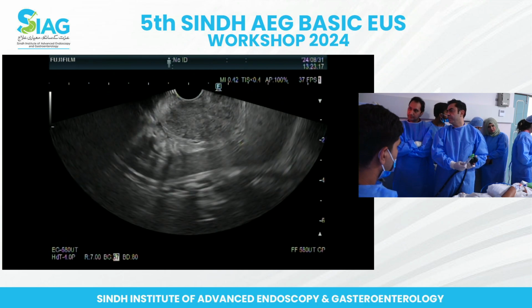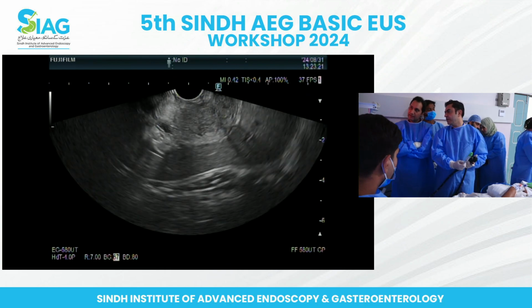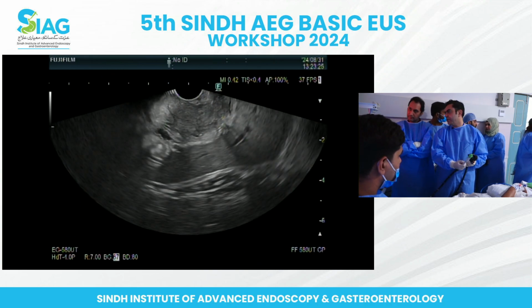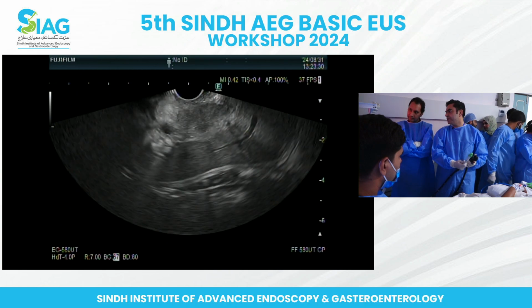That's every single needle. That's how they made it. So you can see, if the needle wheels are facing towards you, it's nicely rested, you rotate it, and the wheels will end up to the right side. There you can see it, yeah.